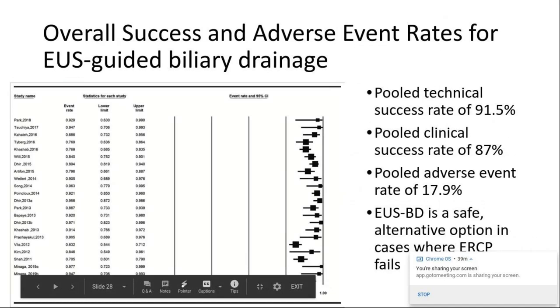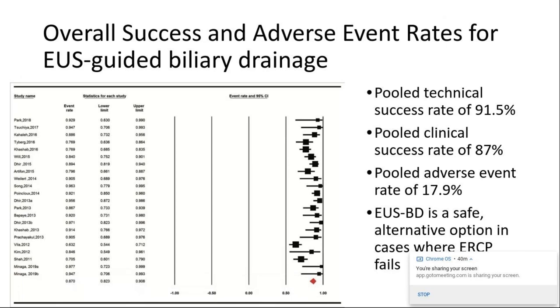So although ERCP is the preferred procedure for providing internal biliary drainage, EUS guided drainage is increasingly utilized in patients who need decompression when ERCP has either failed or is not technically feasible. Now, the reported safety and success rates have been variable across many studies.